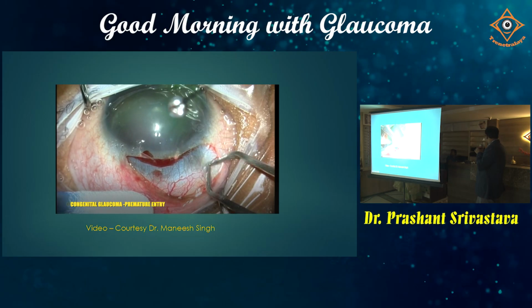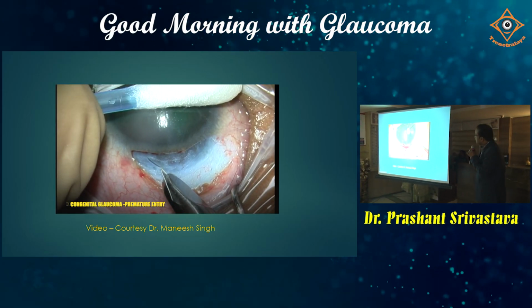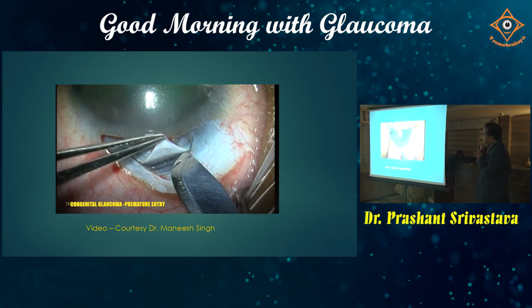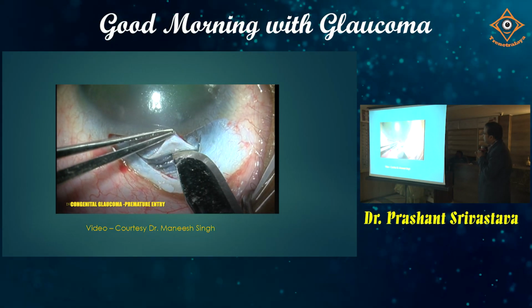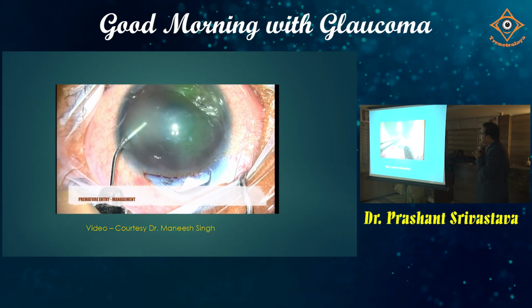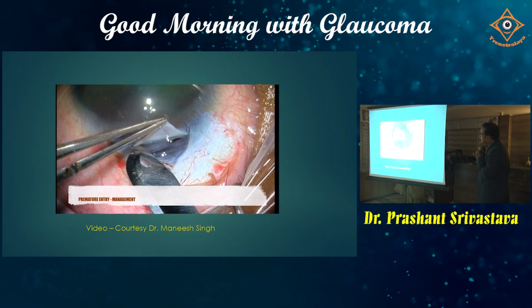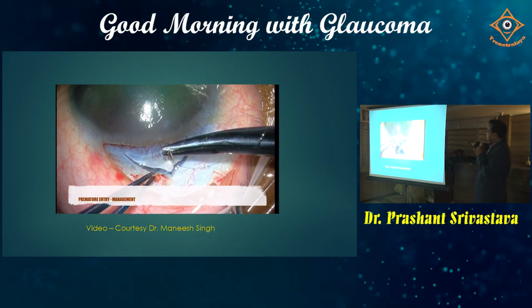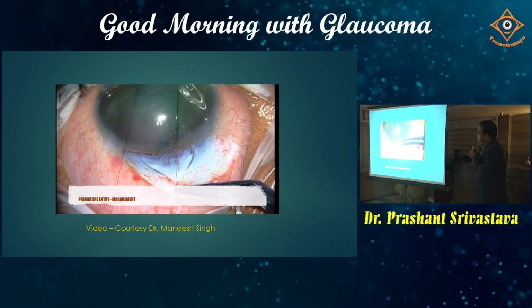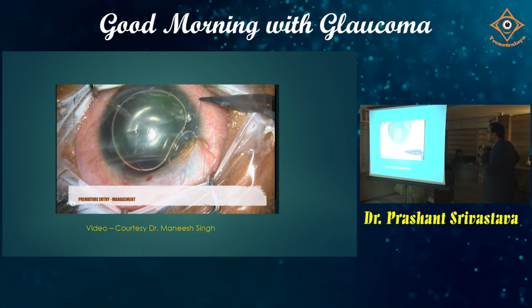Now this video is given by Dr. Maneesh. It's a case of congenital glaucoma, a trab case where premature entry has happened. You see the sclera is very thin, and while making the flap, the bed of the stoma was damaged and the aqueous started leaking. It was also managed conservatively. We went superficial to the flap, superficial to the area of damage, and then it was sutured conservatively. The patient also did well. So small damage can be managed conservatively.